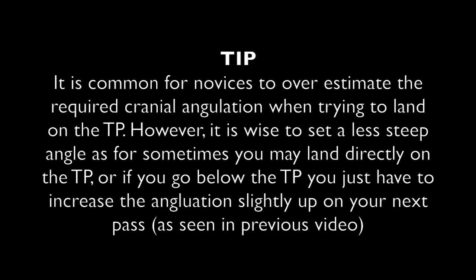It is common for novices to overestimate the required cranial angulation when trying to land on the teepee. It is wise to set a less steep angle, as sometimes you may land directly on the teepee. Or if you go below the teepee, you just have to increase the angulation slightly on your next pass, as seen in the previous video.